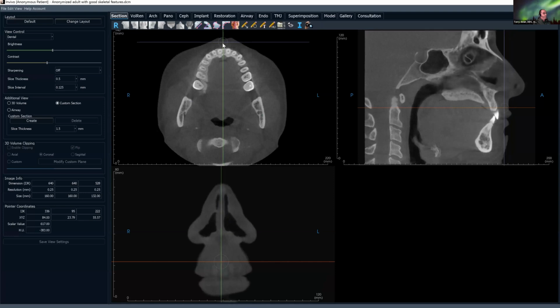We're going to get our first glimpse at the nasal valves. These are the external nasal valves. There are actual measurements here. A lot of it for me is just kind of a subjective appearance. Do they look wide? Do they look narrow? If one side's narrow, it's always going to be this deviation of the anterior nasal septum leaning to one side or the other. And this is just cartilage structure, so it's not that uncommon at all to see a deviation there.